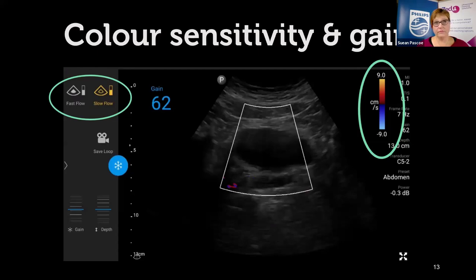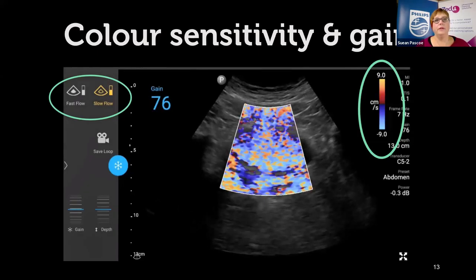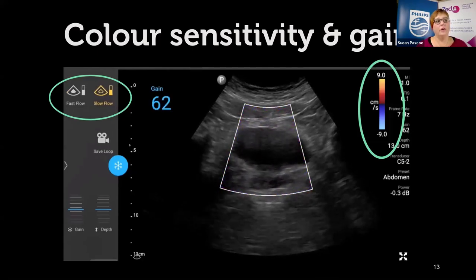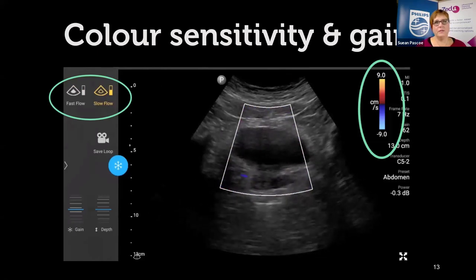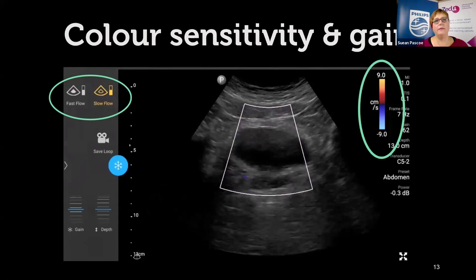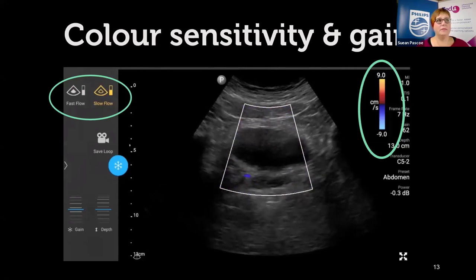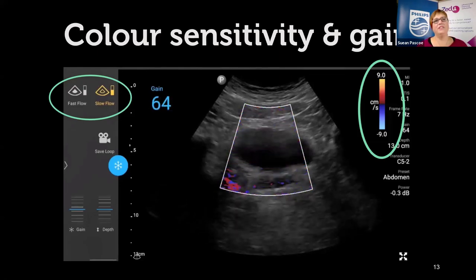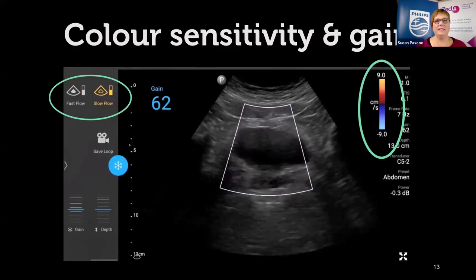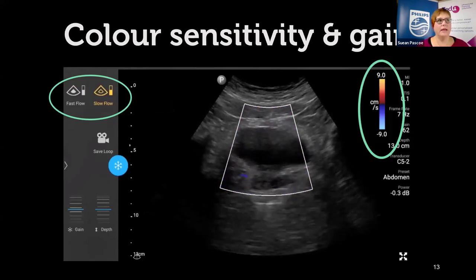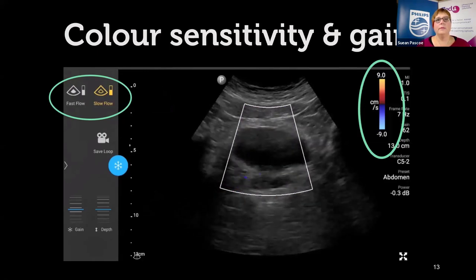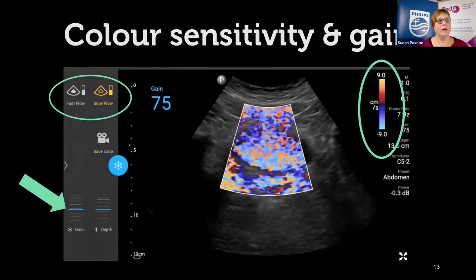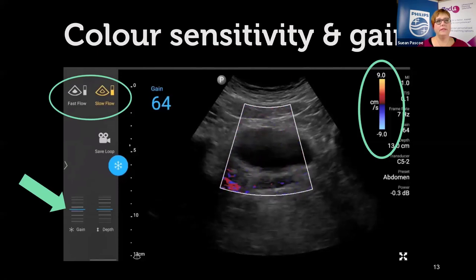Looking at this clip: once you turn color on, the gain button that usually controls B-mode gain now becomes the color gain. You wind it right up until it flares, then turn it back down until that flash just disappears — that means you've optimized your color settings for seeing the ureteric jets. You can see on the side here I'm winding up the gain settings and then winding it back down.